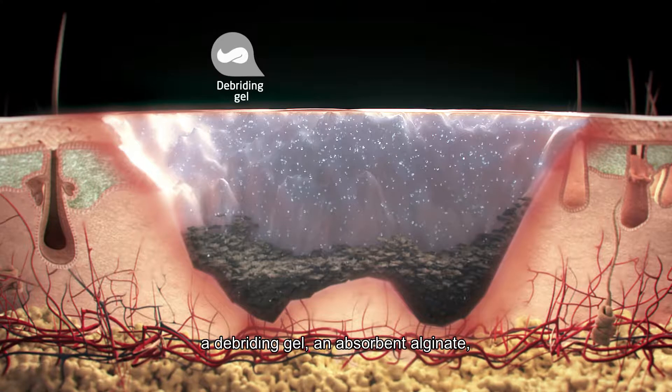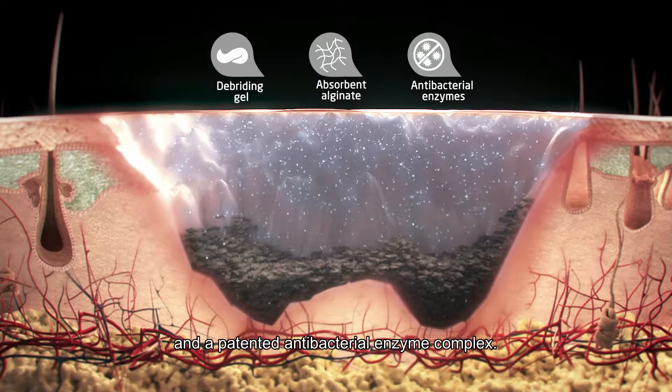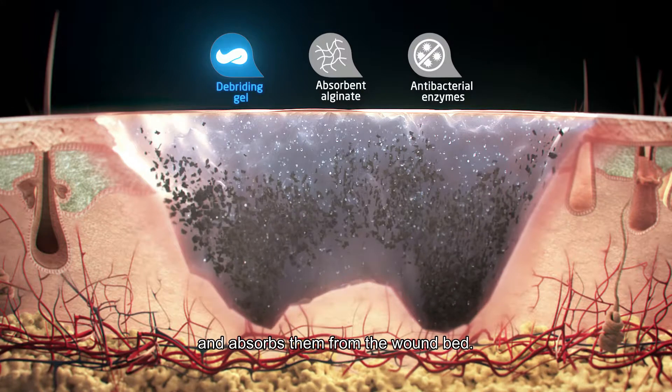Flaminal has three key components: a debriding gel, an absorbent alginate, and a patented antibacterial enzyme complex. The gel dissolves necrotic tissue and fibrin and absorbs them from the wound bed.